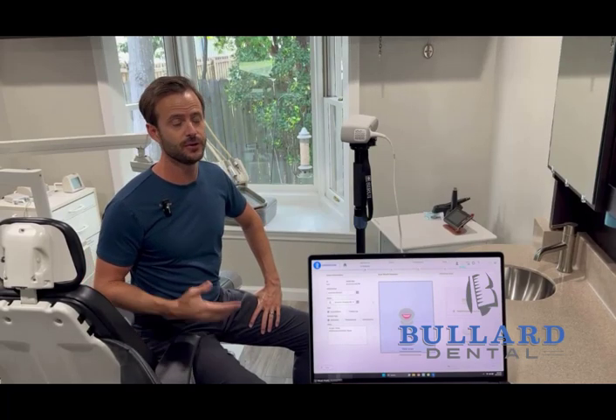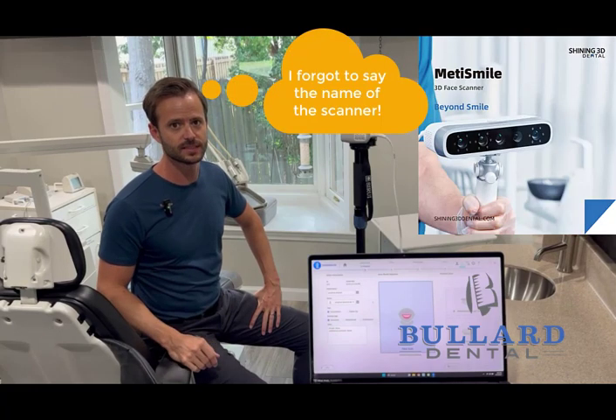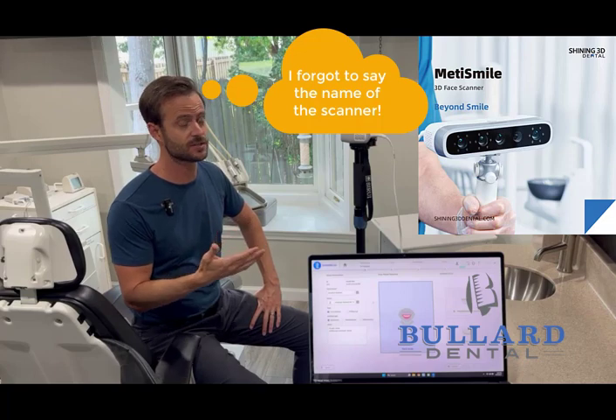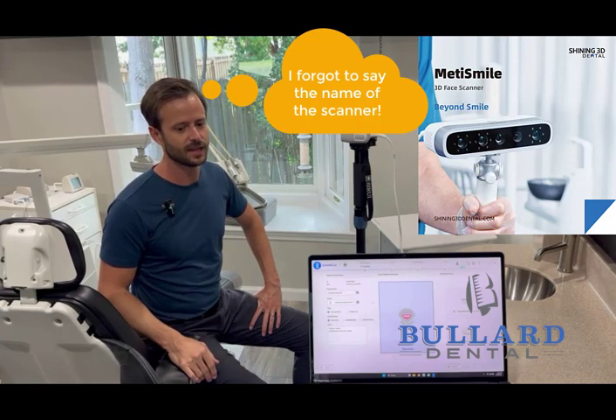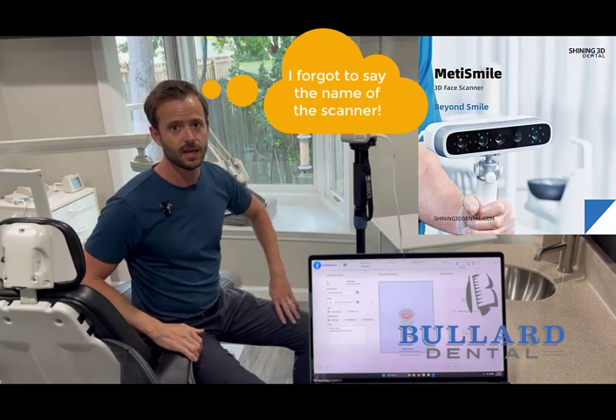Today we're going to show you our new face scanner. We just got this in yesterday and we're really excited about it. We tried it out yesterday and today we're going to run through it one more time. We're going to show you the setup, how we capture the scan, and then after that the setup in ExoCAD.